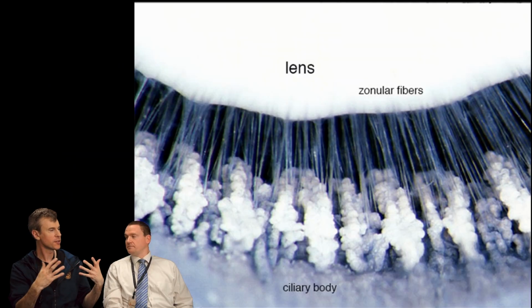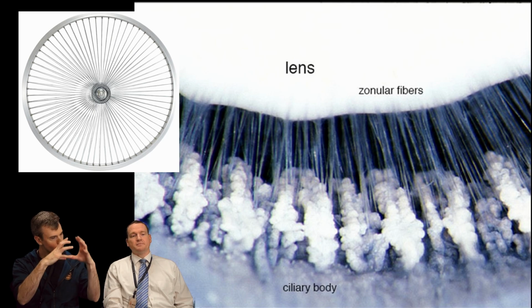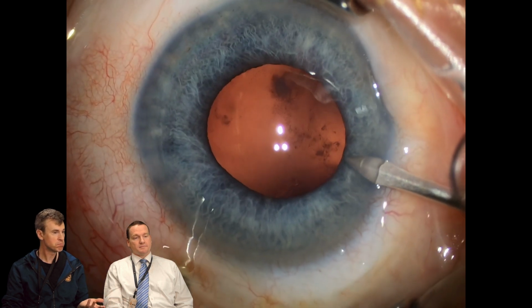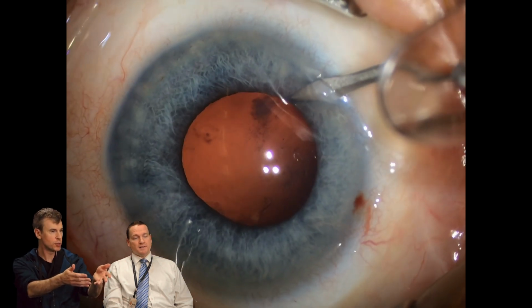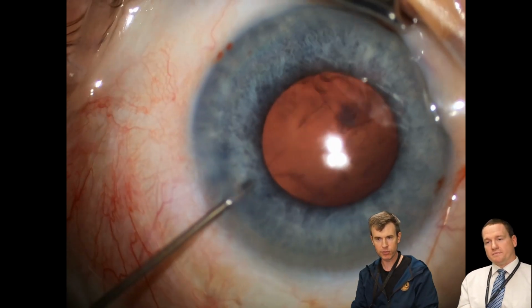And going back to the zonules, I usually compare them to the spokes on a wheel that keep the hub in place. And if they're broken, the hub falls, which is the lens. But by the time we're in the operating room, there's nothing there. It's just an open pupil looking straight at vitreous. This looks like a mid-dilated pupil.